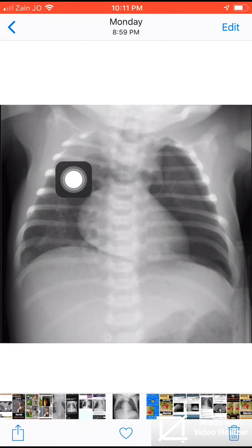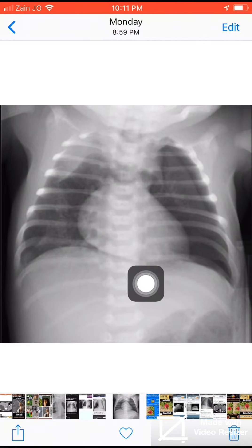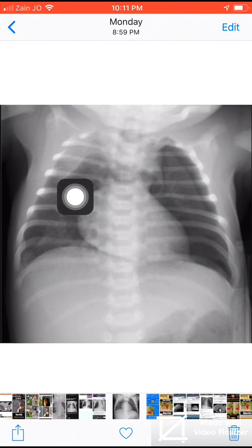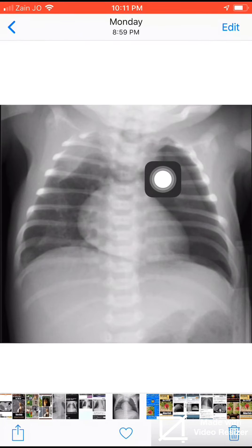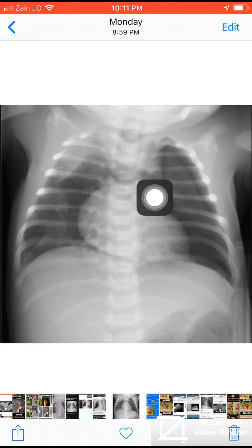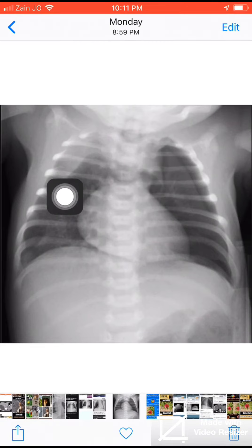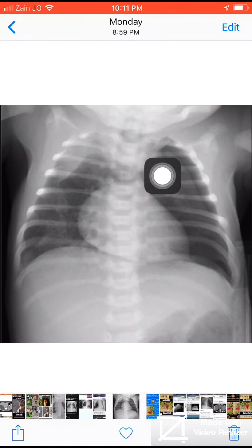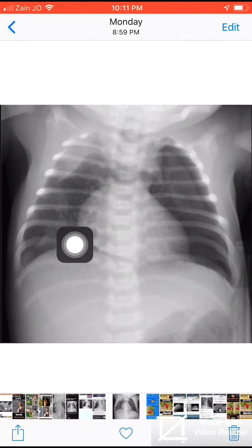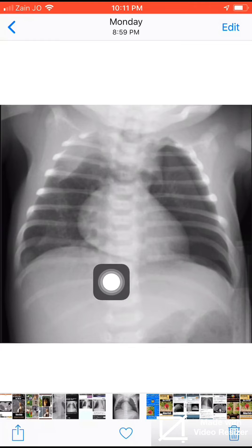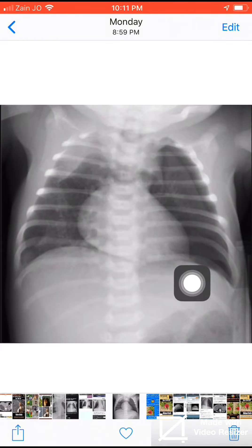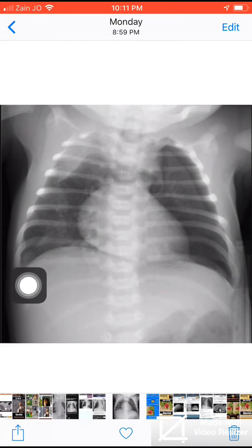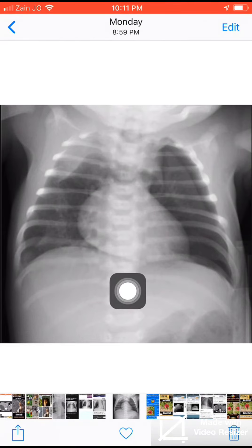We also see pneumomediastinum, manifested here by elevation of the thymus gland, which is displaced more to the right side. The heart borders are well outlined on both sides.